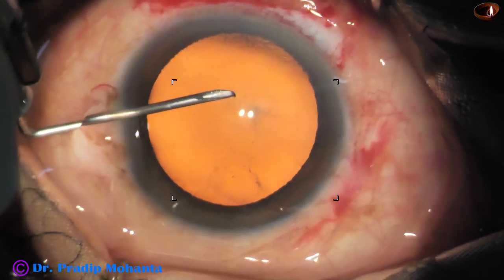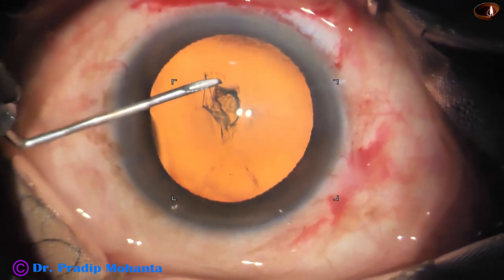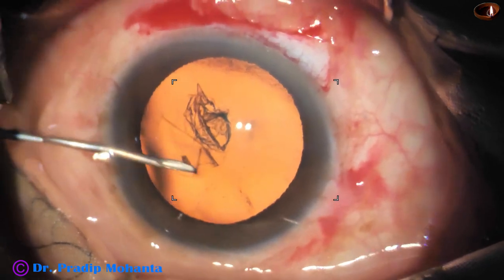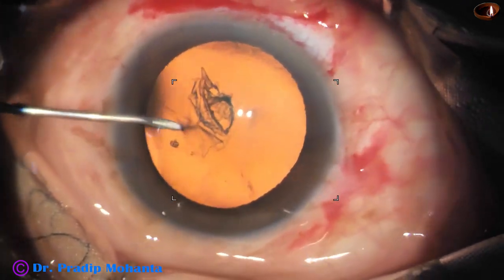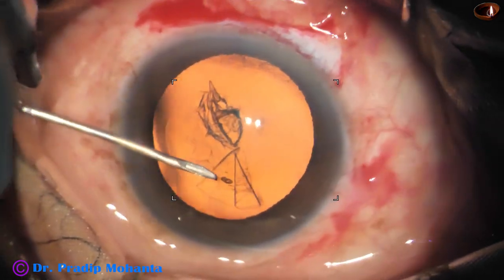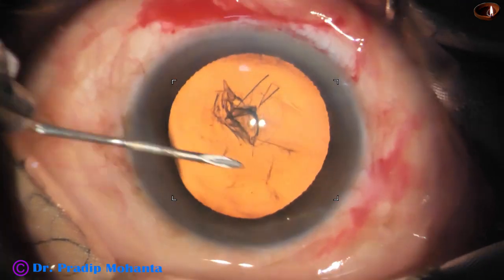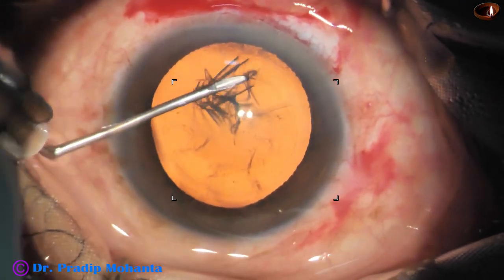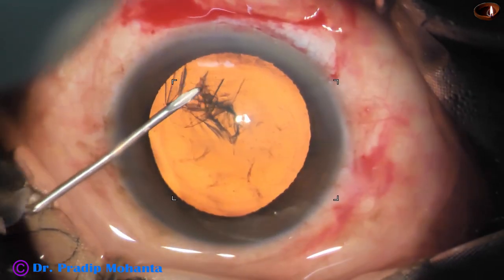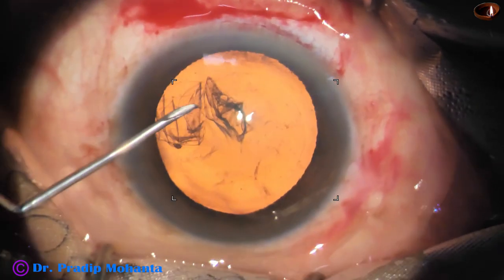With this kind of red glow we do not need any dye. A straight cut is made from 12 o'clock to 6 o'clock, the 12 o'clock end is pulled, we get a flap, the flap is flipped and guided up to 3 o'clock, and from 3 o'clock we pull the flap up to 9 o'clock to complete the capsulorhexis.